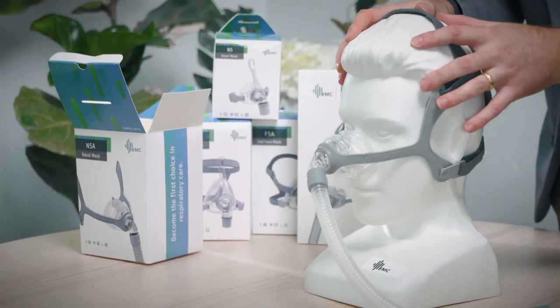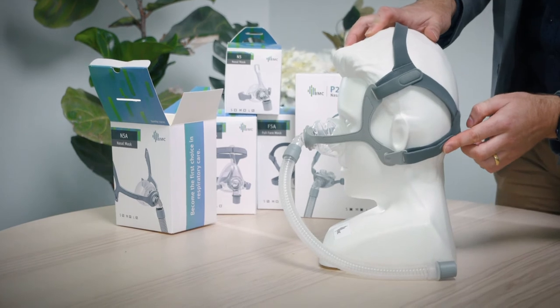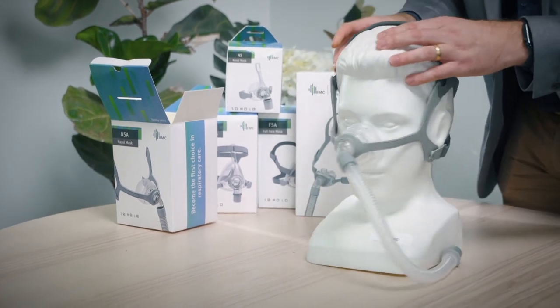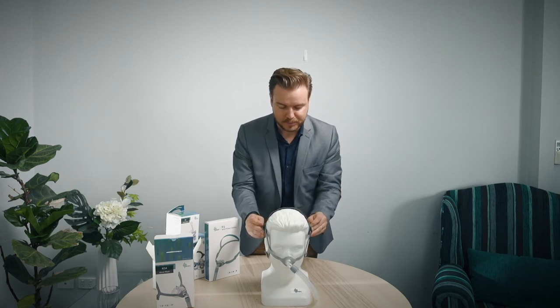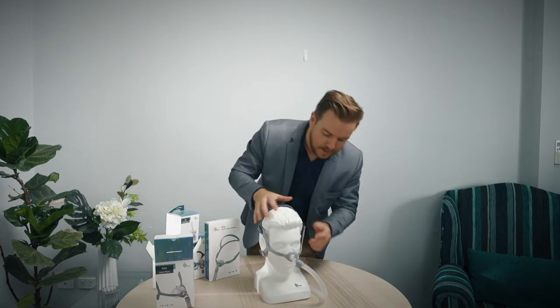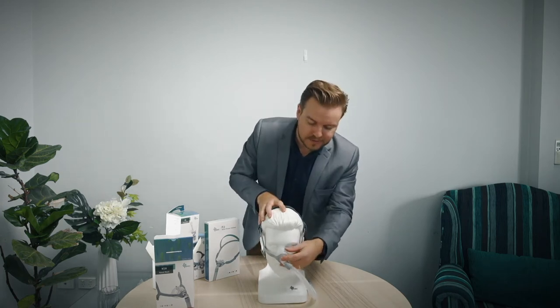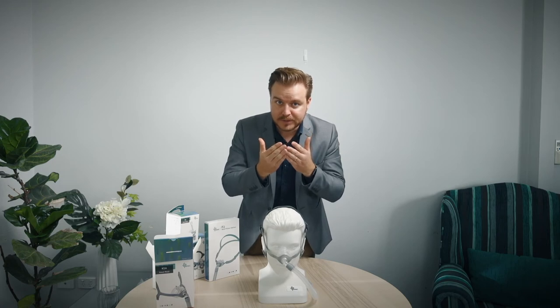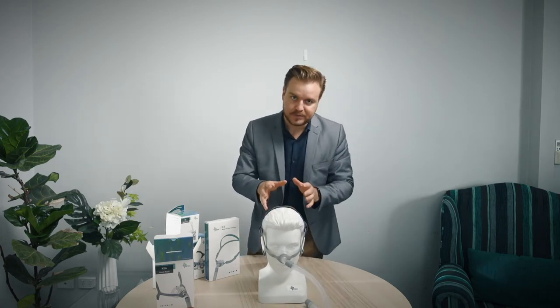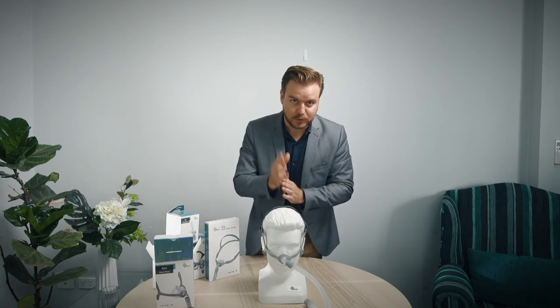When fitting the mask you've got four points of adjustment — velcro on either side and then clips. Ensure that it's even so when the mask is on your face you're pulling it evenly on either side, and down the bottom as well, so it's evenly pulled and the cushion is snug against your face but not too tight. You should do a mask fitting test to see that there are no leaks around the cushion when wearing it.